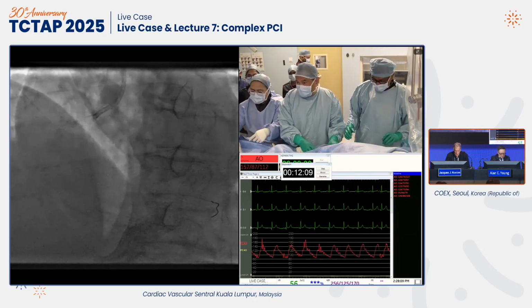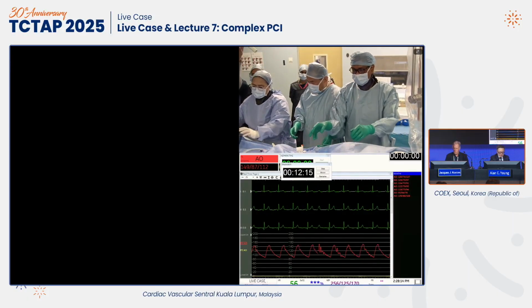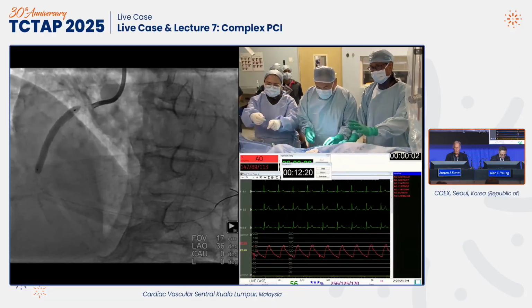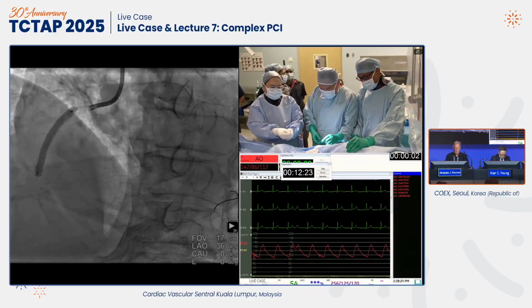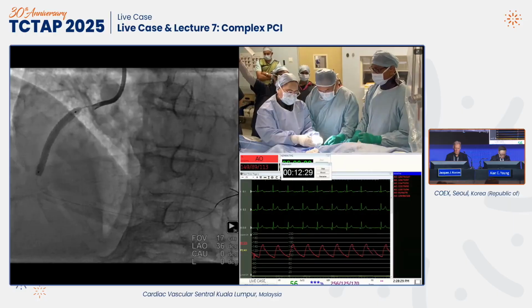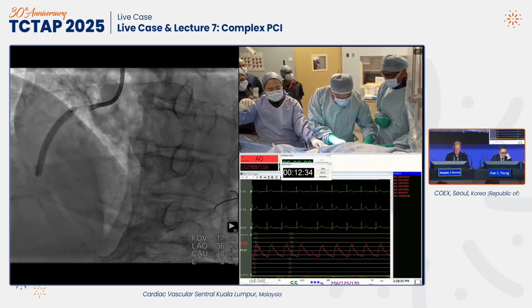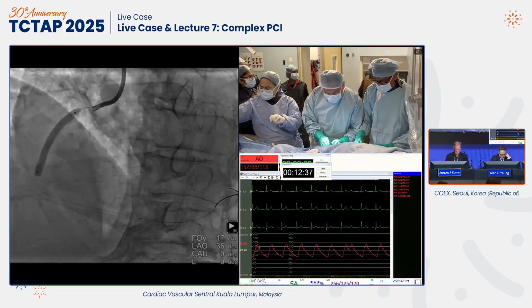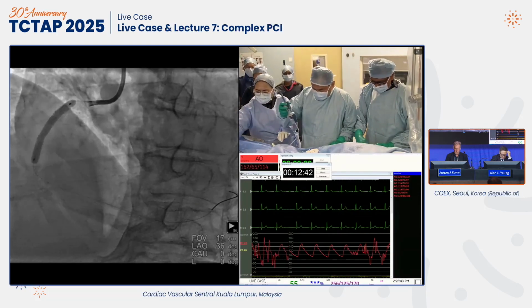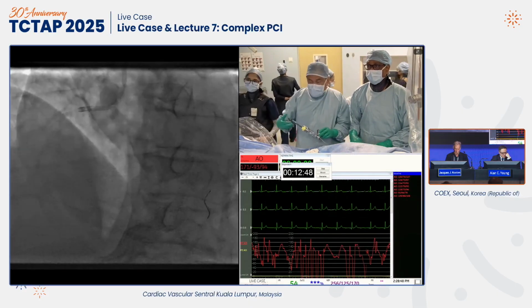The first one is the bioadapter trial from Japan involving over 400 patients. Now we have 2-year data, and the 3rd-year data will be presented next month in EuroPCR, which shows for the first time the long-term outcome to be superior. This is followed by a large study, 2,400 patients. First-year data is presented, and 2nd-year data will be presented at the TCT meeting. This is not the best platform to talk about it, but you will see it's about reducing future events using bioadapter.